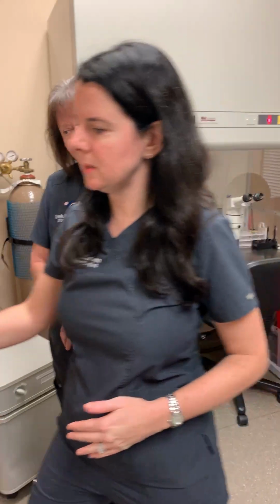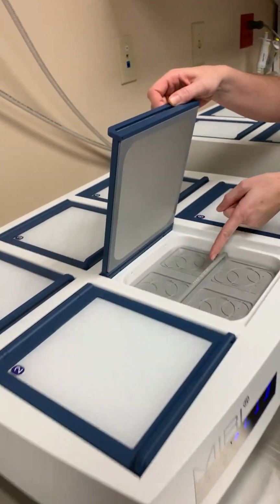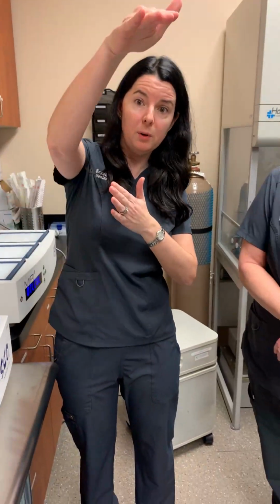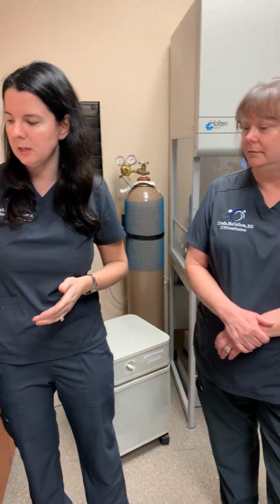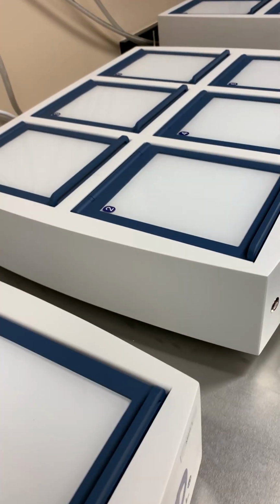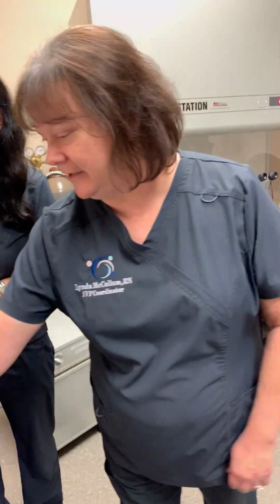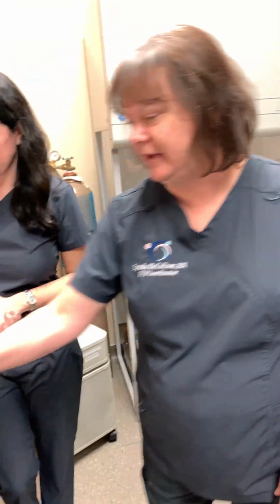Yeah, this is wonderful. So, Miss Sarah, on these, do you just have one patient's embryos in each little separate container? Yes, so there's 18 total that you can use. There is a divider on the inside here, so if we had all 18 spaces full and we didn't want to move to our backup big one, we can divide each one. But as of right now, you would have 18 patients at one time. Well, that must be sensitive because I saw this change when you opened that up. Yep.